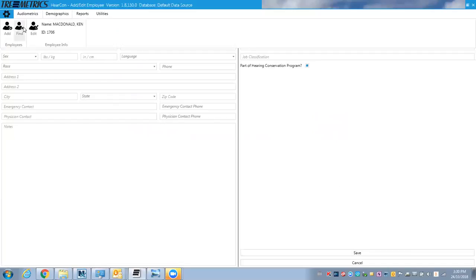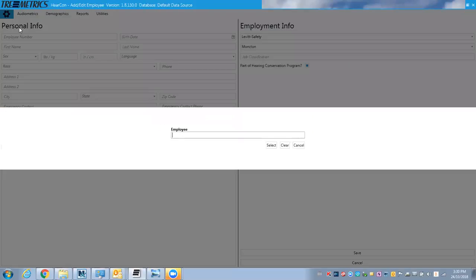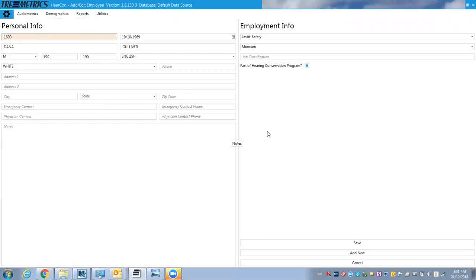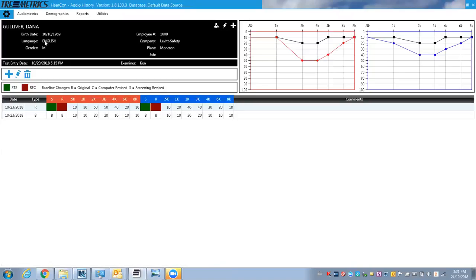I can also do find. So say if I have already added a few people, if I start typing their name it gives me some options. I can select them from there and then select them and their information will be loaded. So now we've got Dana loaded in here.